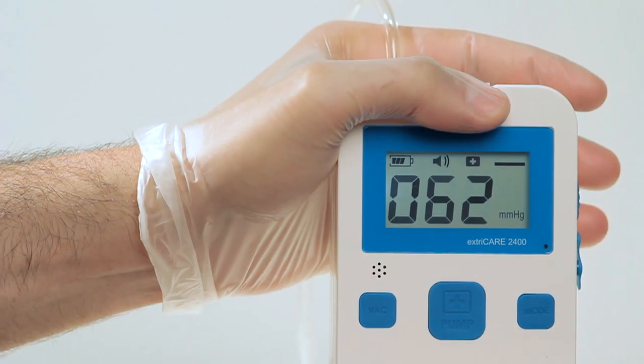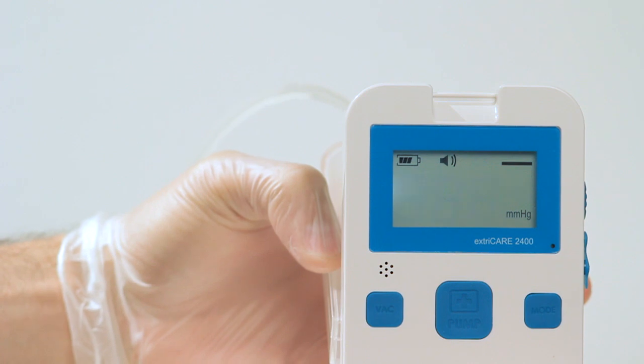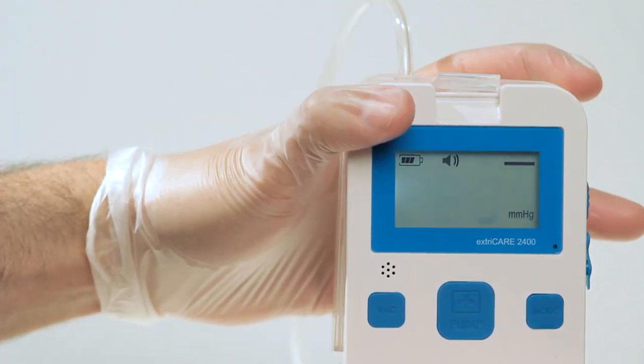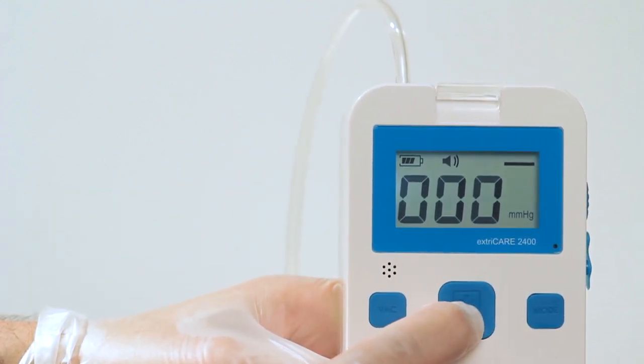If the canister is not detected or installed incorrectly, the ExtraCare will not operate. The alarm will sound twice and the LED light will flash red, green, and yellow until a canister is installed properly.